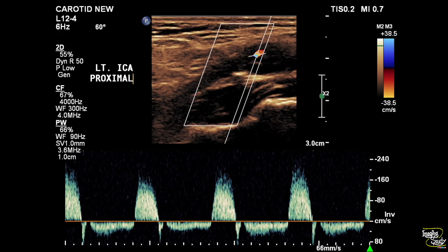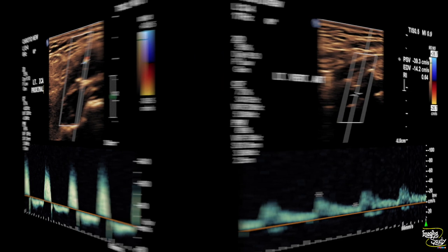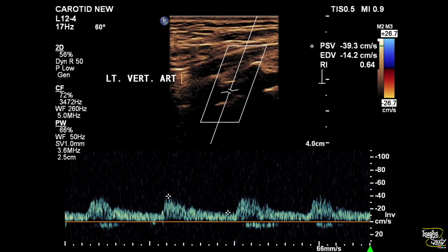Here you can see the spectrum with bidirectional flow and a peak systolic velocity of more than 200 centimeters per second. Now let's end with the left vertebral artery, which is giving antegrade flow with a normal velocity.